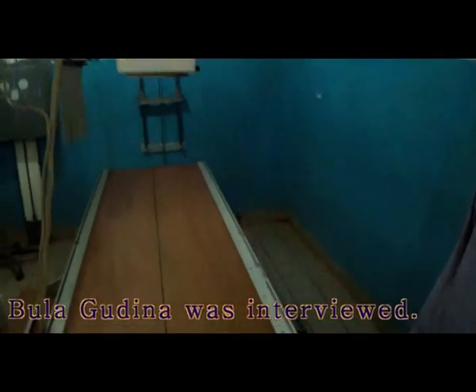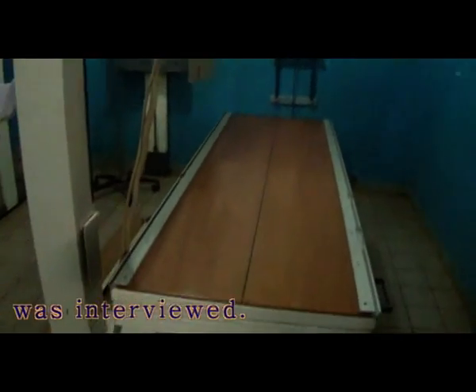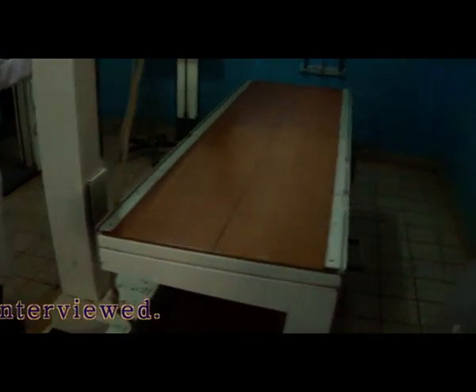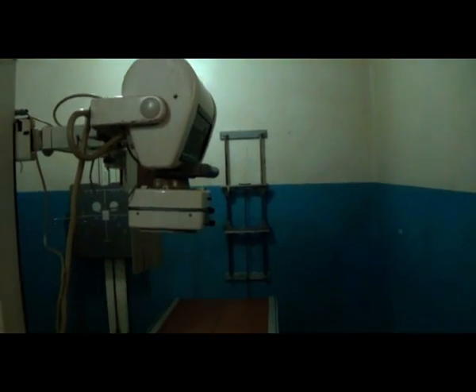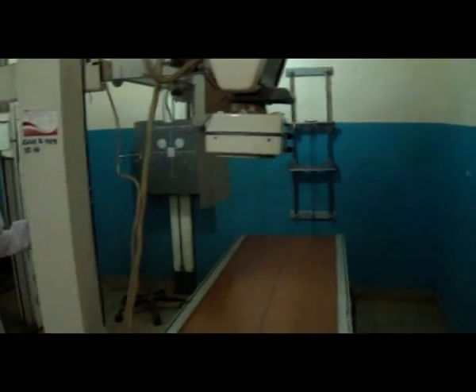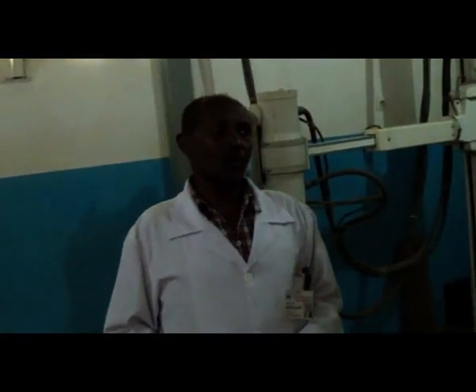Some of the parts are very rusty, and we have tried to repair it many times, sometimes 2 times in a year, we have to call the technician to repair it, but it is almost out.